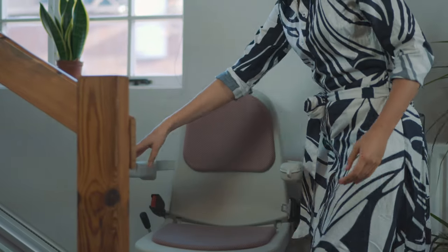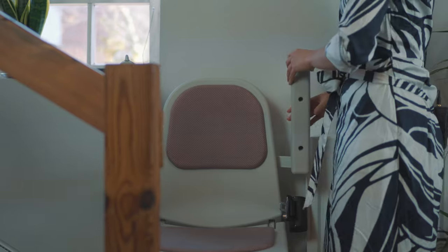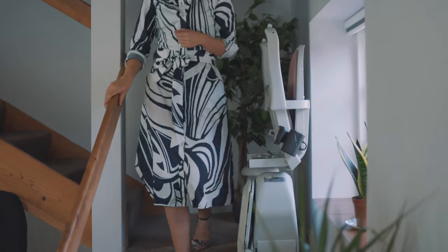When it's not in use, push the seat, the arms, and the footrest up, and this allows enough room for people to walk by. With every stairlift installation, you are given two remote controls.